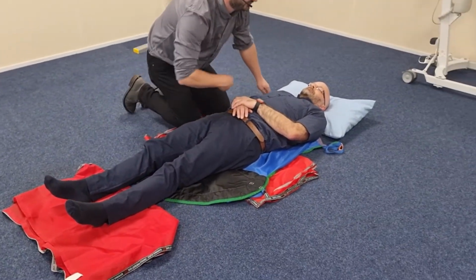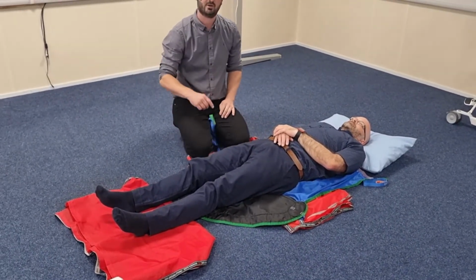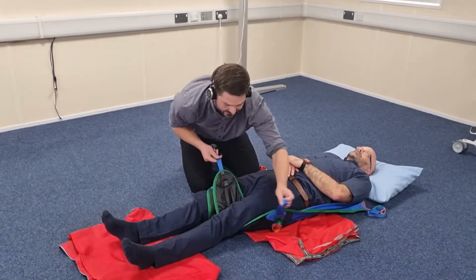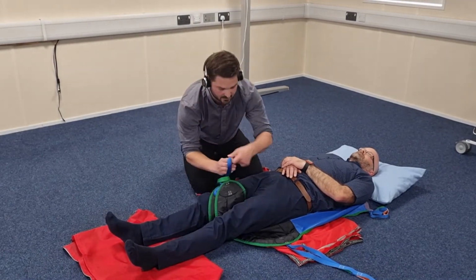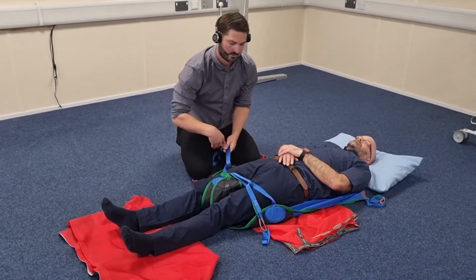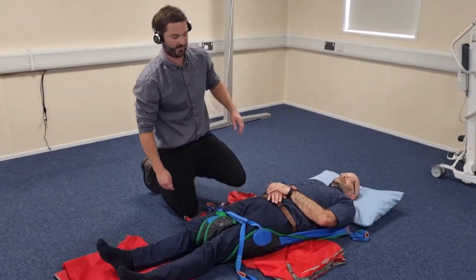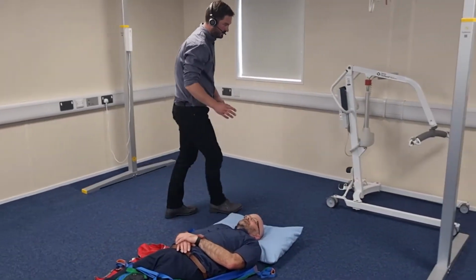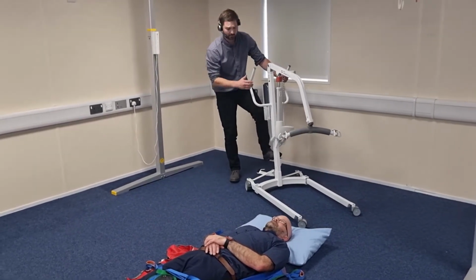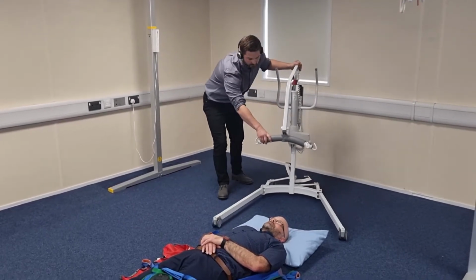Double check my sling, make sure that it's fitted evenly, and then I can start to join the leg loops, the leg pieces together. So this is a divided leg sling. Once that's done, I'm going to look to introduce the mobile hoist. Like I said, this is going to be done from the head end. So I'm going to begin by opening up the legs to the widest position. I'm going to come in at an angle.